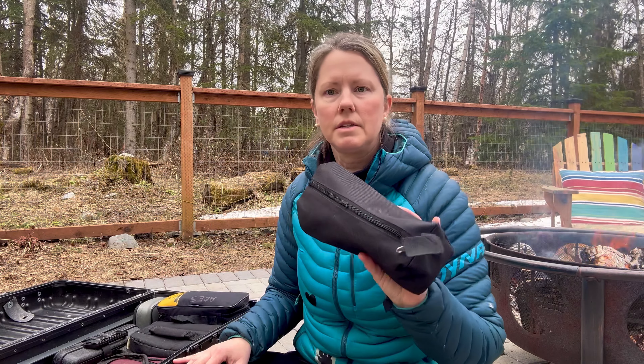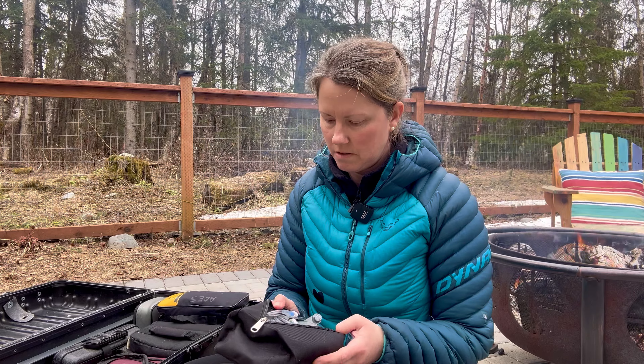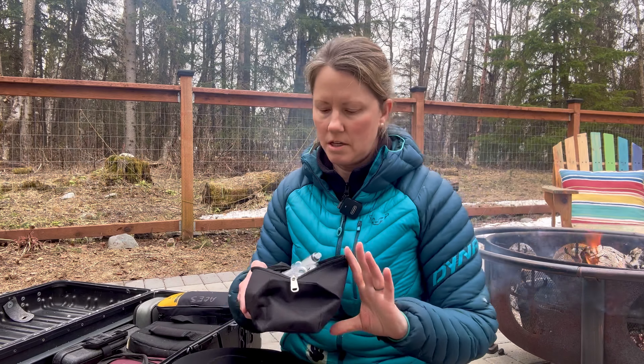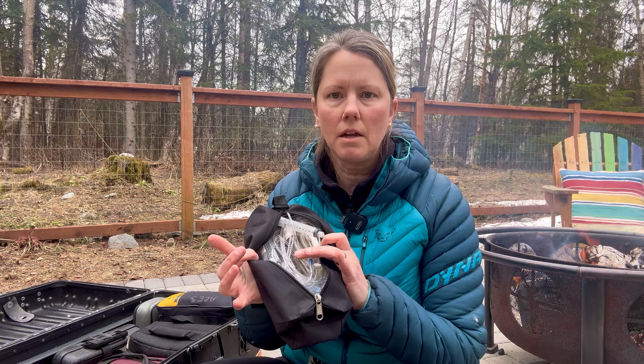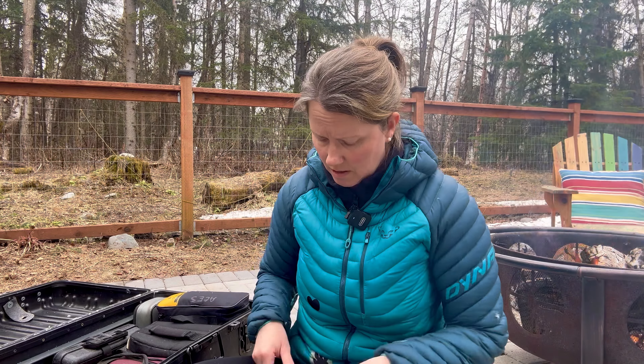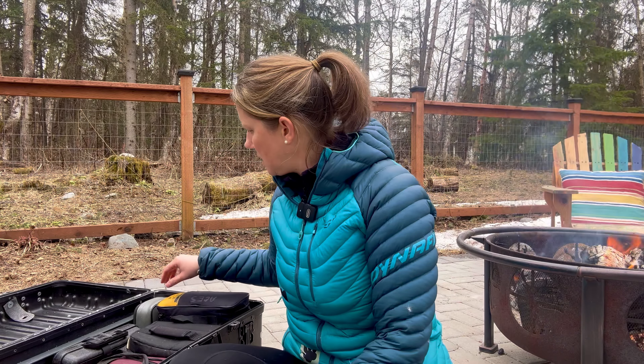This bag is for my collection of different types of infusion tubing that I need to carry with me, because I'm dealing with all types of infusion pumps, so this one is dedicated to that.